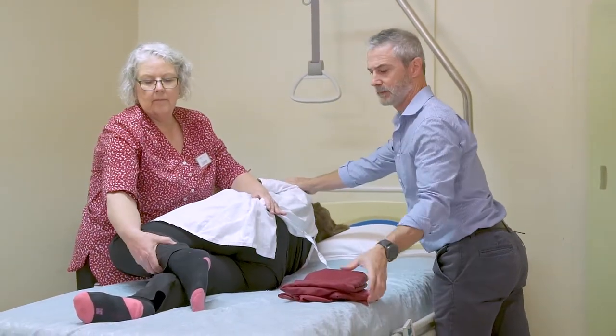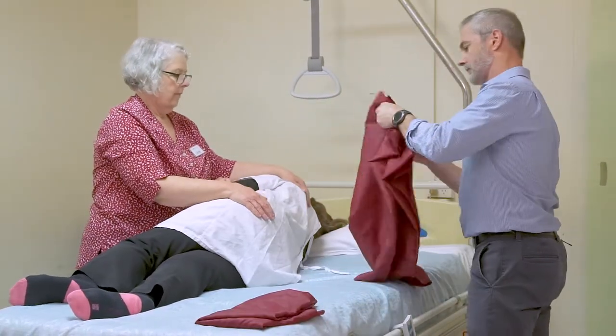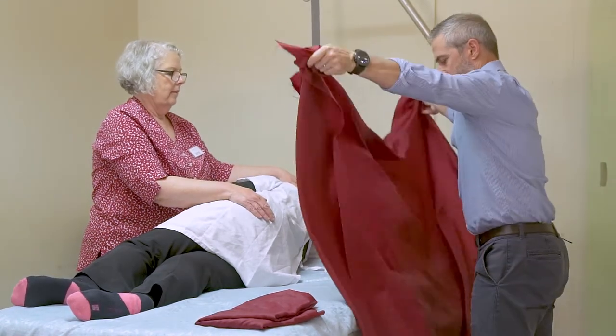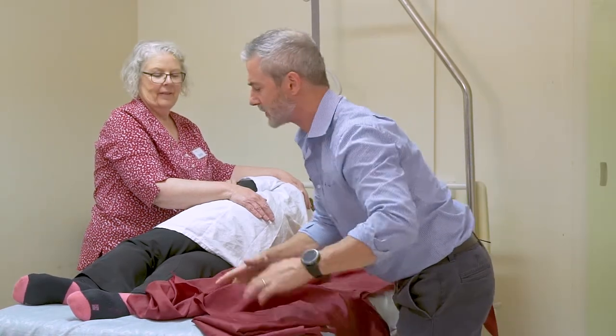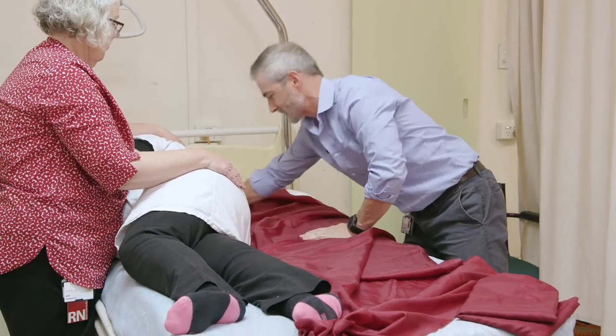You're going to support while I position the slide sheets underneath the patient. Two slide sheets fully extended to cover the whole surface of the patient's body.